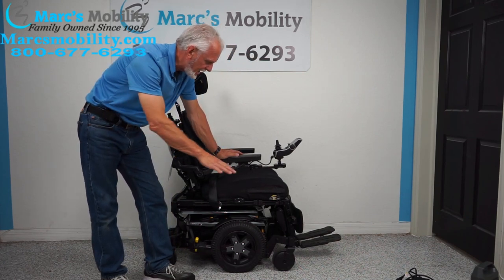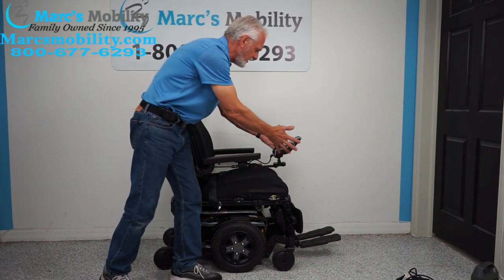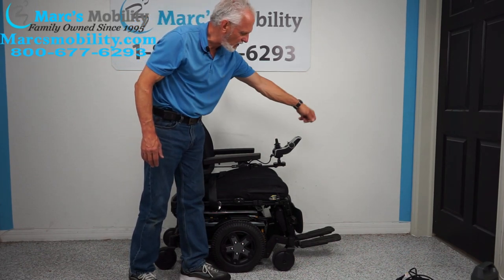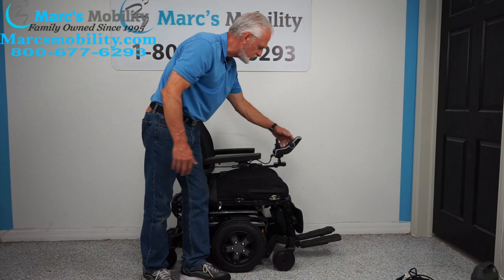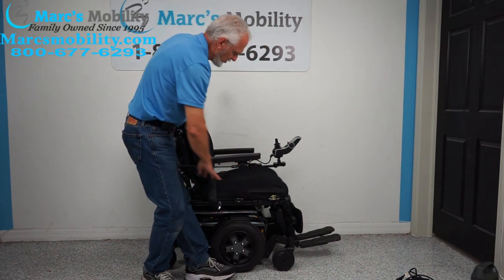To make all the functions work — go up, back, recline, legs, whatever you need — it all has to be done through the joystick. There's a button on the left to turn the power on. Once the power is on, keep pushing the button forward until you see a picture of your seat on the screen.